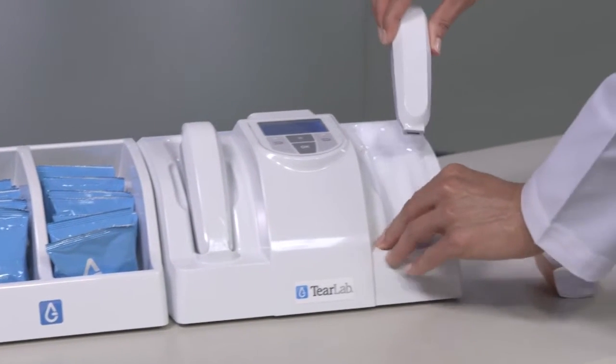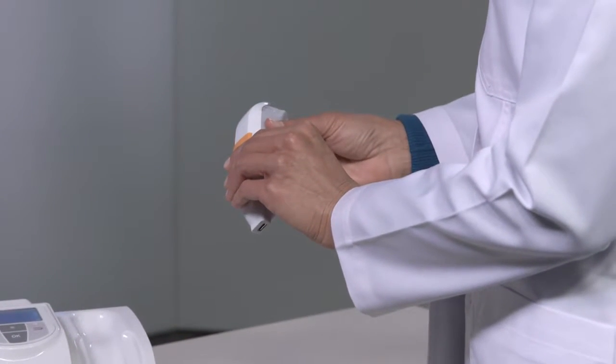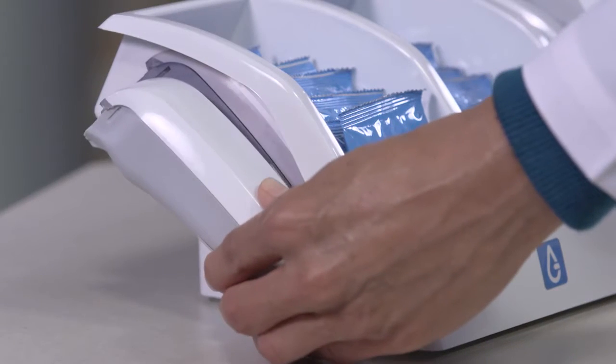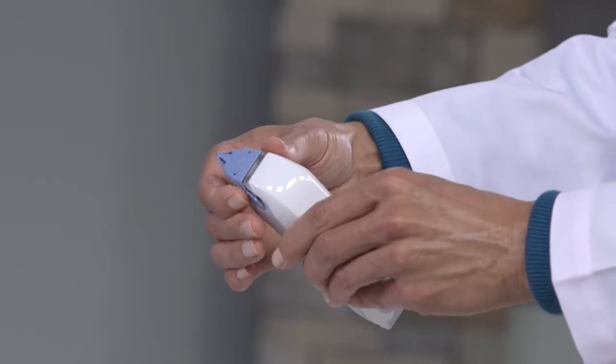Only when you are certain that the pin is fully charged, reset the pin with the magnet by using either the magnetic pin sleeve or the magnet on the side of the test card tray. Next, test the pins using an electronic check card.